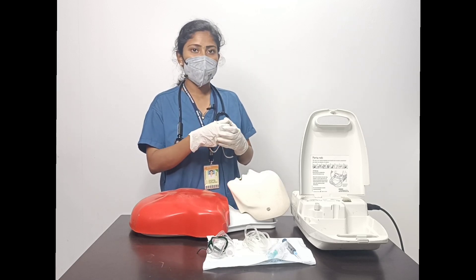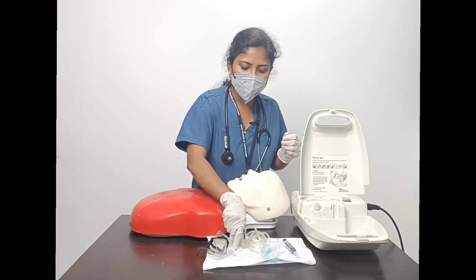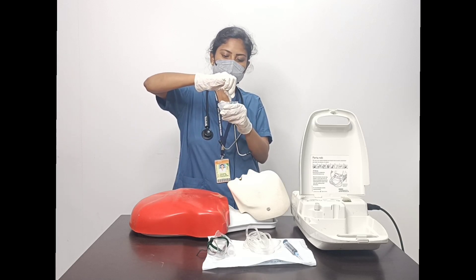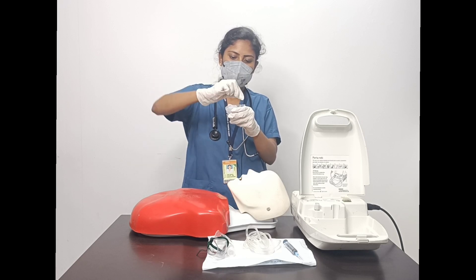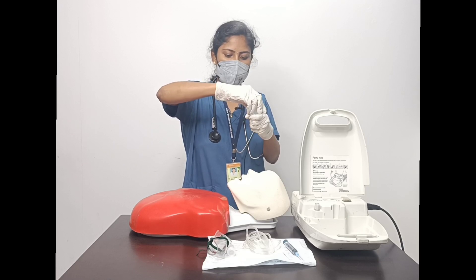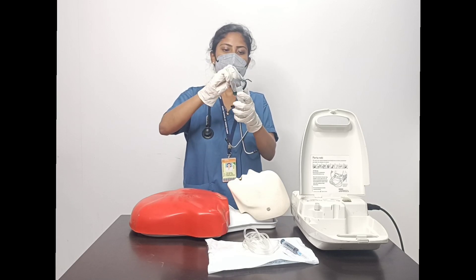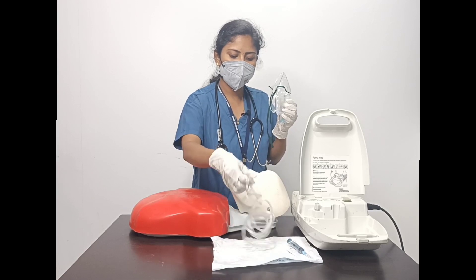Before giving any procedure or medication, take standard precautions. Then take the medicine prescribed by the doctor and place the medicine into the nebulization chamber. After that, connect the face mask and connect the nebulization tube.